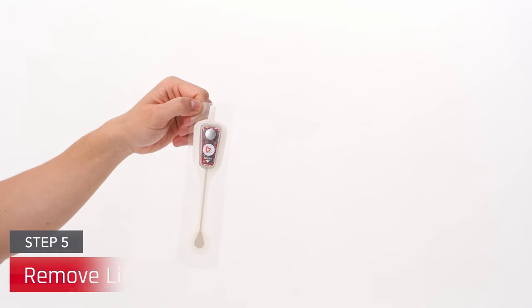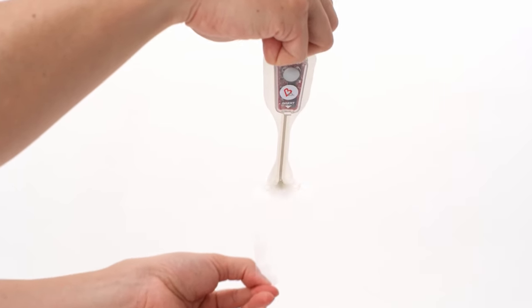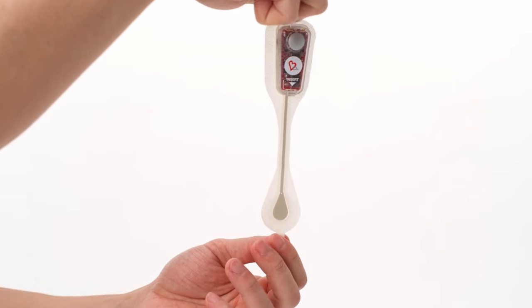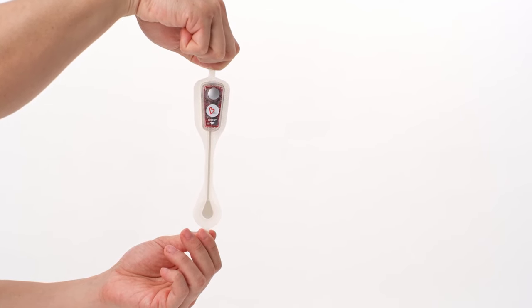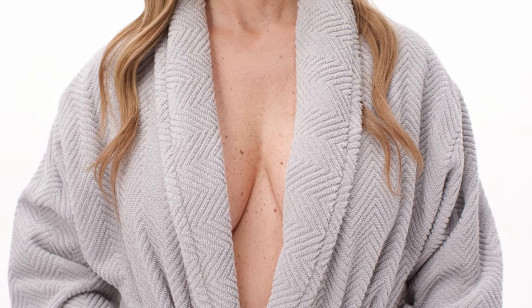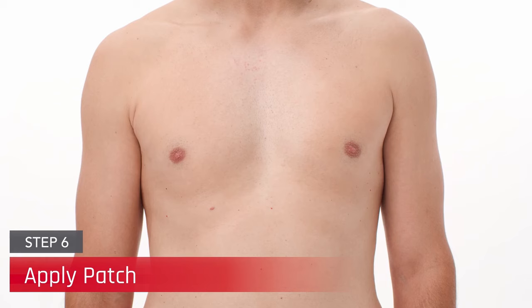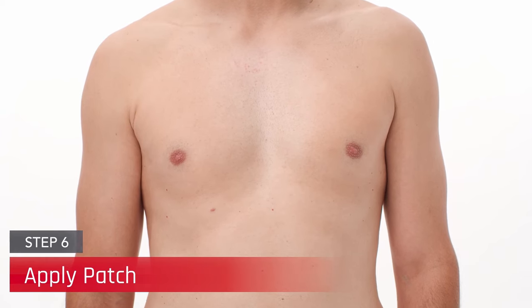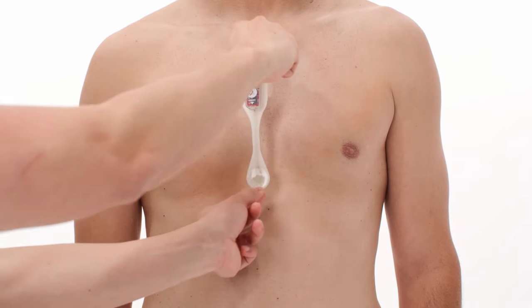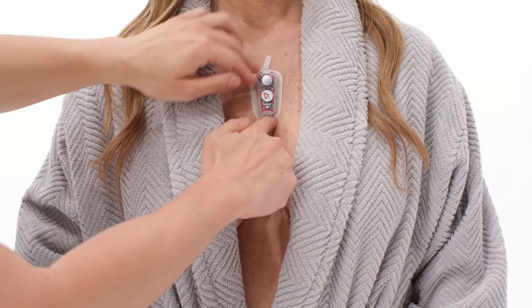Gently peel the liner from the CAM patch by grasping the tab at the top of the device and peeling downward. Handle the CAM carefully by holding on to the top and bottom tabs, ensuring the patch road does not fold over on itself or come in contact with anything other than the patient's sternum. Prior to applying, ensure the chest is completely bare and free of clothing to optimally place the CAM patch. Locate the xiphoid process at the bottom of the sternum and apply the CAM to the patient's chest with the bottom part seated over the xiphoid process.